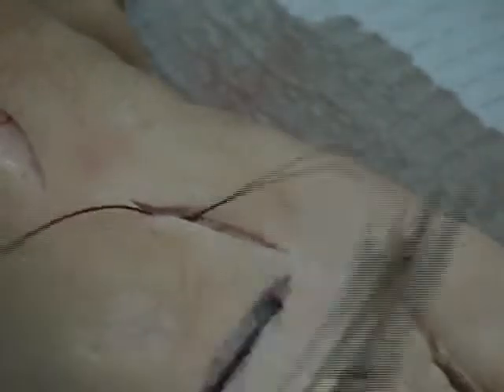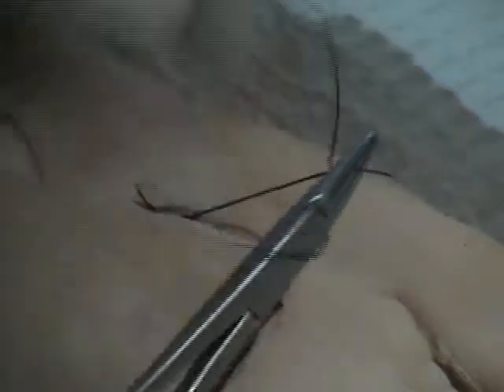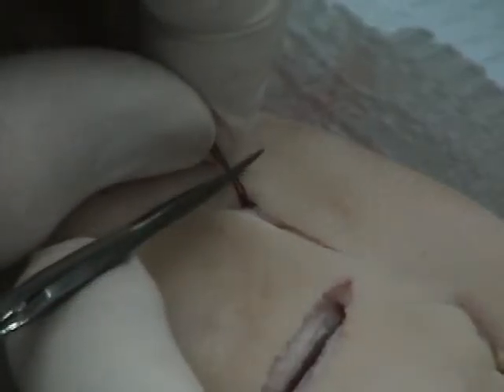We would be using an absorbable type of suture, like a vicryl or chromic gut — something along this line that will actually dissolve inside the body. You cut it fairly close. And then I can go ahead, close this up, and stitch whatever kind of stitch I want to put across the top to finish closing this up.